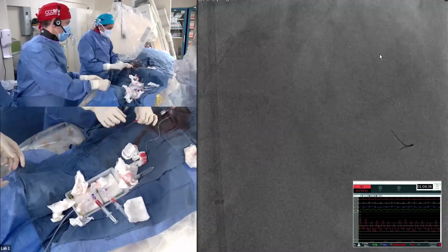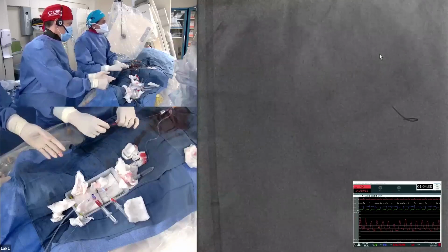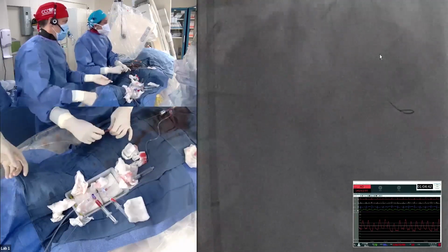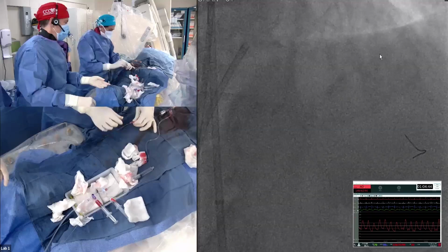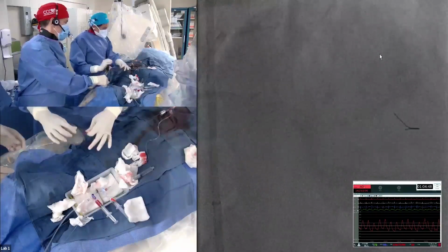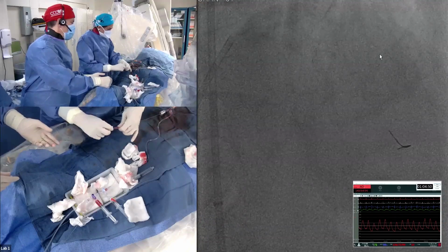This is a situation like, don't try this at home. Yeah, exactly, because more people will be scared to remove that wire from the LED, because the initial wiring was not easy. Yeah, I think that's what I would be.